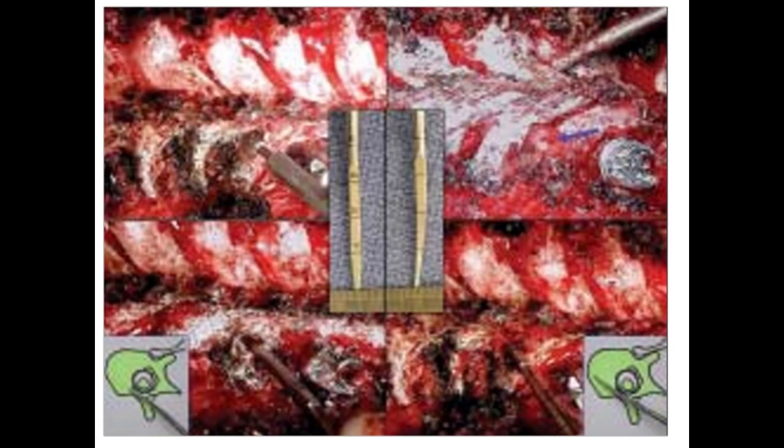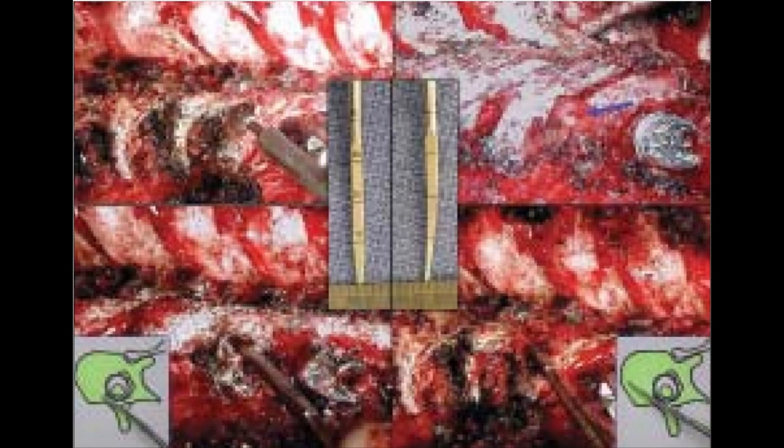So this paper also describes the thoracic gear shift mechanism, by which you can use the curved gear shift. To cannulate the pedicle, you can use the straight probe to probe the pedicle, or you can use the curved probe. In that curved probe, first the curvature should be outside, and then once you pass it across the pedicle, then you can make it towards the midline.